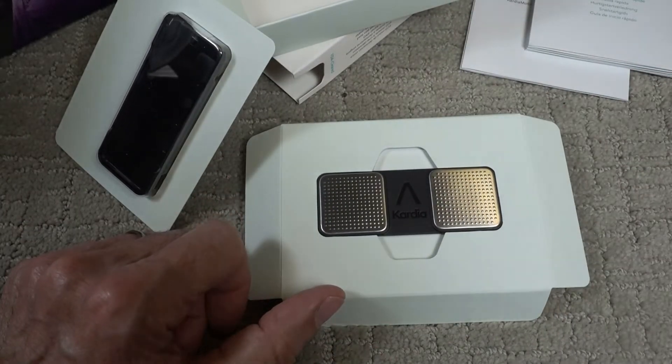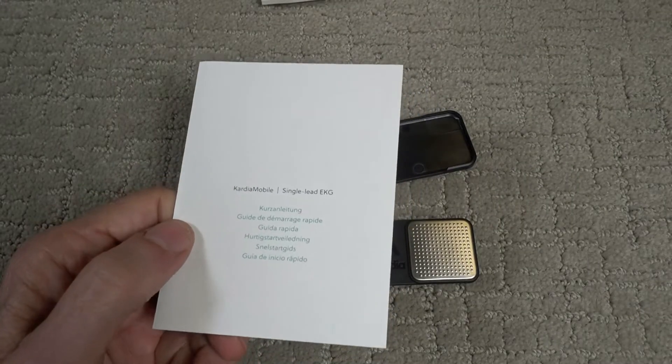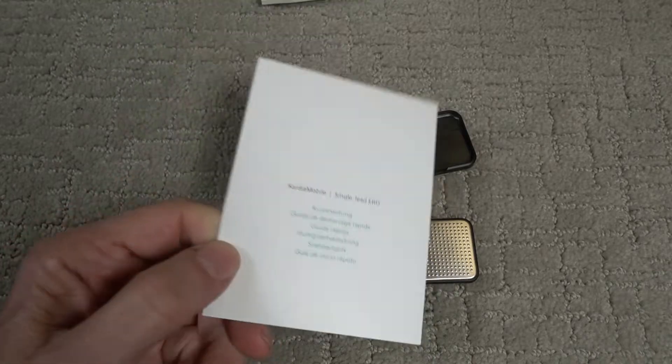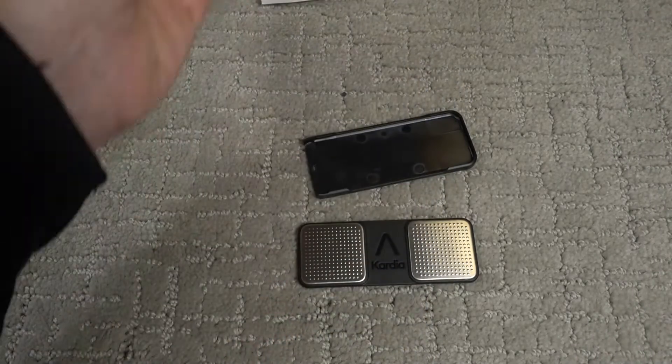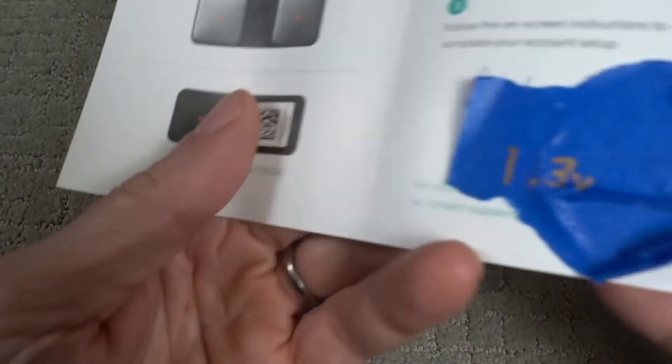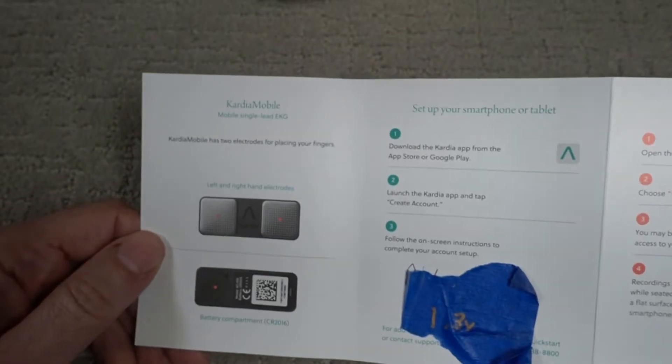I better read the directions. So this booklet is unnecessary unless you speak a language other than English, because there's every other language but English on this one. So this is the brochure you'll need — it's a quick start manual.